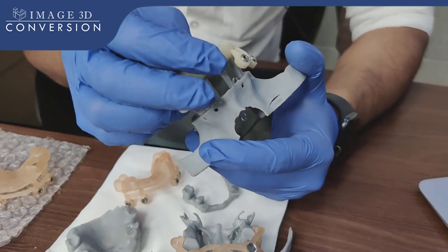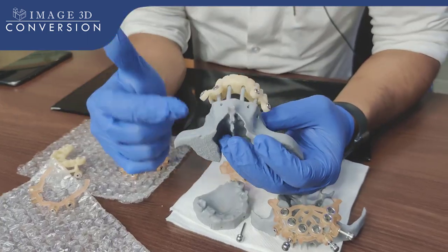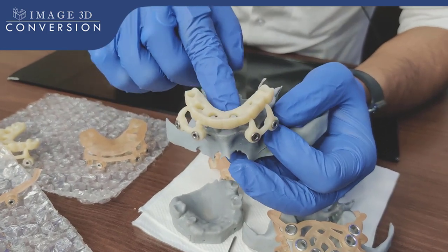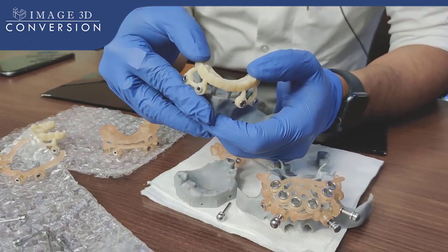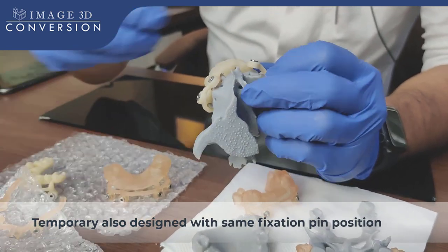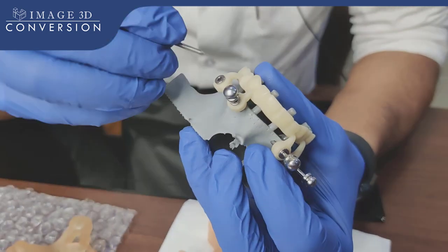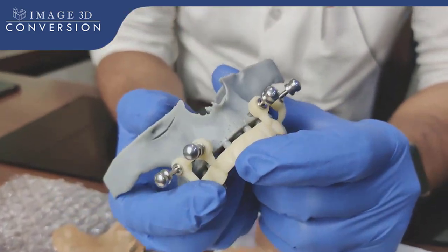Before the surgery, I can verify if I am going to have any difficulty in stabilizing this prosthesis. We have fabricated this bone model with the abutments, and we converted the existing dentures into a temporary with pre-made pickup holes. We fabricated the model with the abutments so that we can verify before surgery if there is any trouble seating the temporary or taking the pickup. I can see it's sitting properly. With the same fixation pin positions, I will index the fixation pin to take the precise pickup of the temporary. I can take the pickups precisely and the stabilization of the temporary is good with the same indexing pin positions.